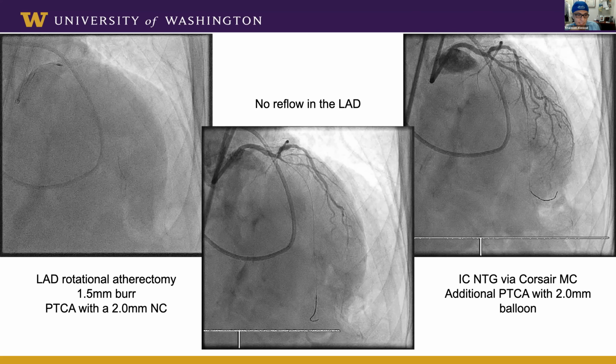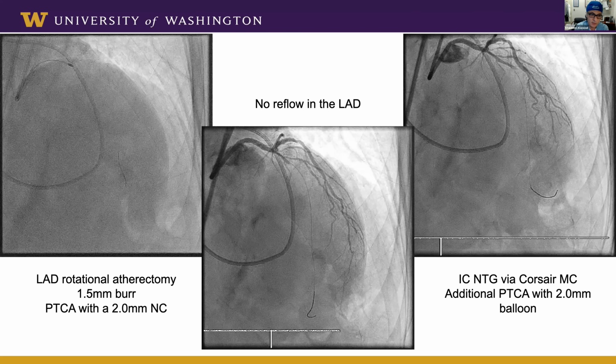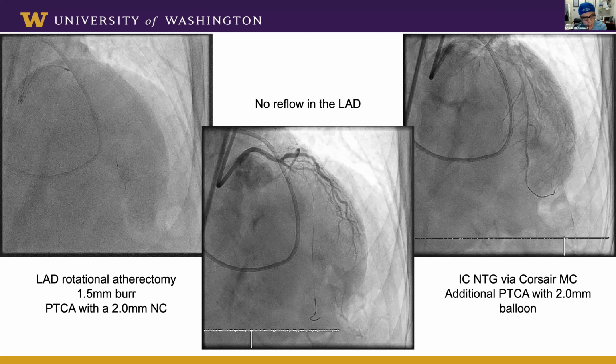I twirled with the idea of no vasodilators because we were having hypotension. We use anesthesia, the patient goes to sleep, and blood pressure goes to 40 every time, especially with the CSI. But since I went back to putting vasoactive material in the flush, I've had fewer no-reflows. Yeah, that's interesting.